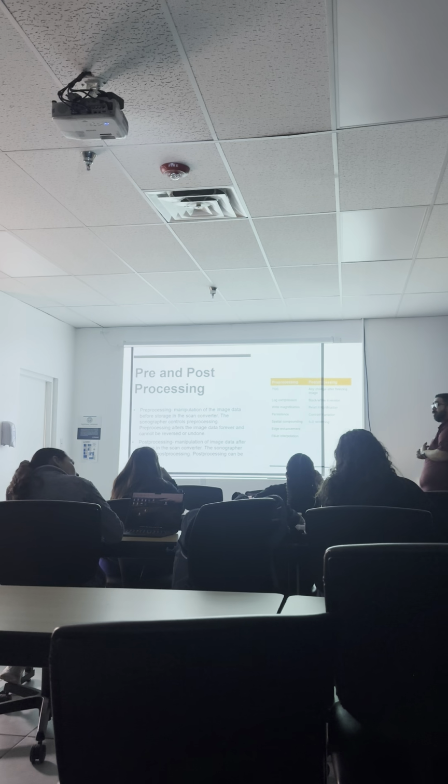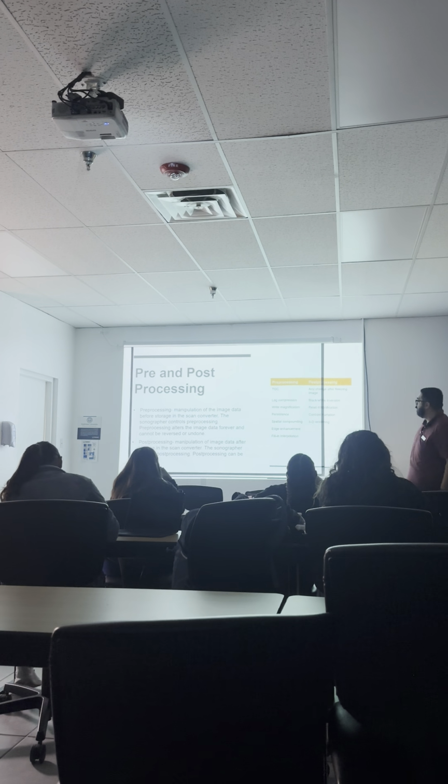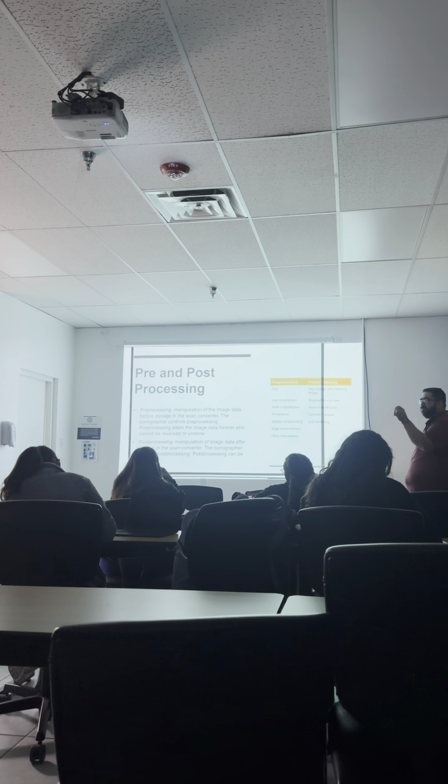Is there a button for that? Yes, it says edge on the machine. On some machines, not all machines have edge enhancement, but most of them do. Does that affect bio effects? No, it just has to do with amplifying the echoes at those borders.